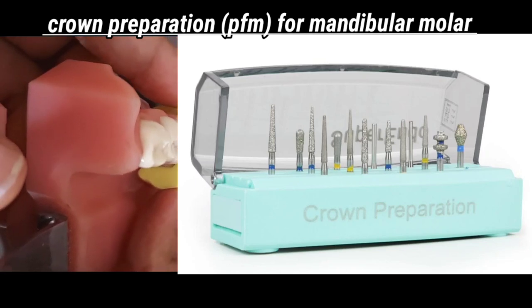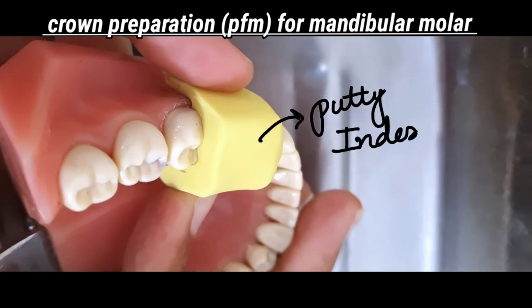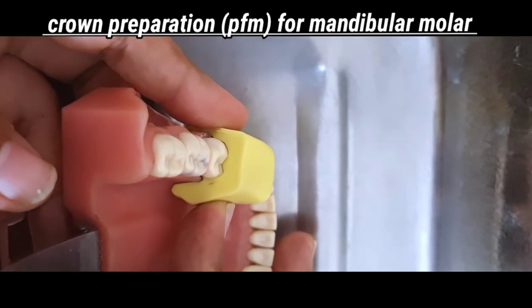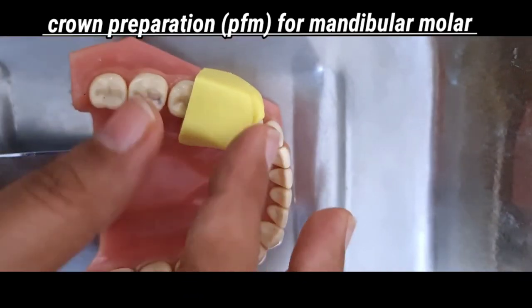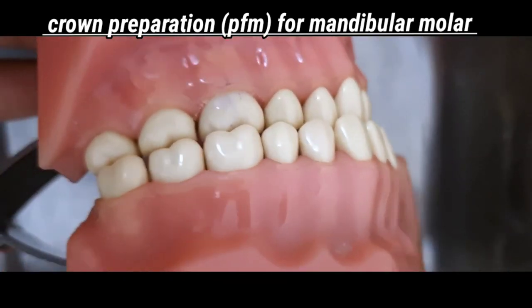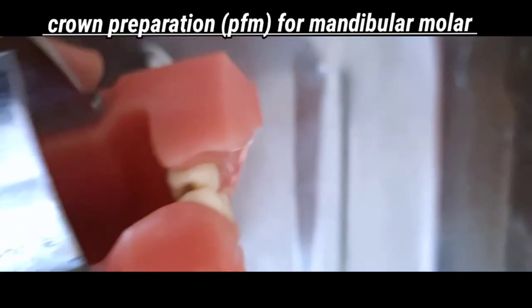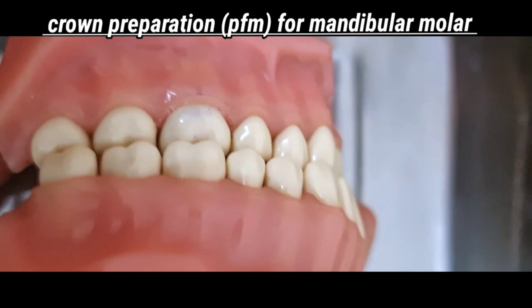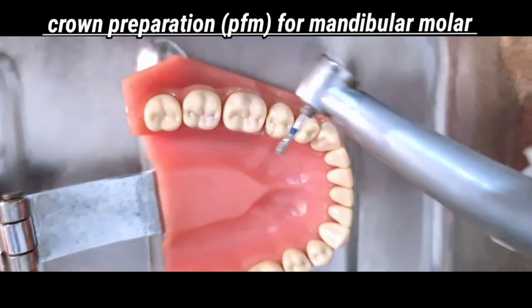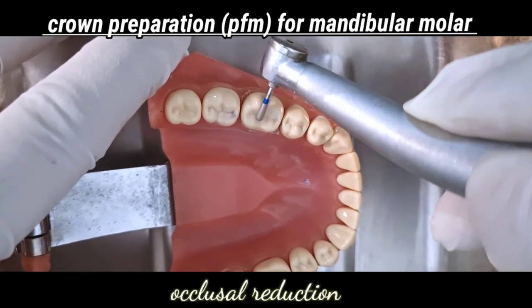Before starting with the tooth preparation, we record the anatomy of the teeth with the help of this putty index. A pre-treatment putty index is made with either an addition or a condensation silicone that is kneaded into a small ball and adapted over the tooth surface. Once this ball of putty index is set, we cut it sagittally, not in the middle but over the cusp, with the help of a blade. Once we get this pre-treatment putty index, we start with the occlusal reduction.